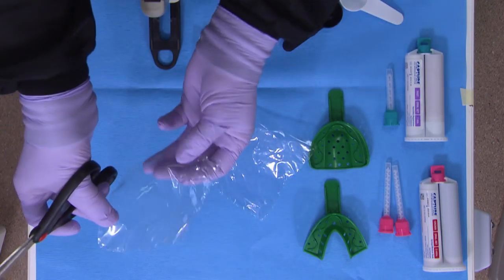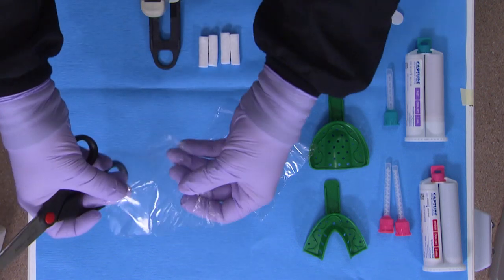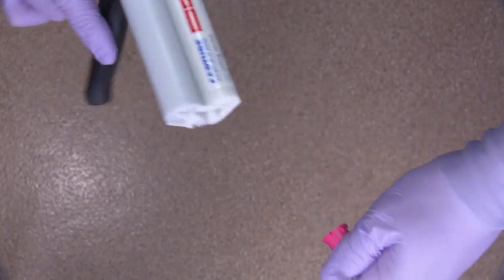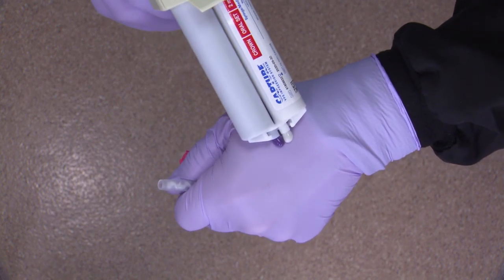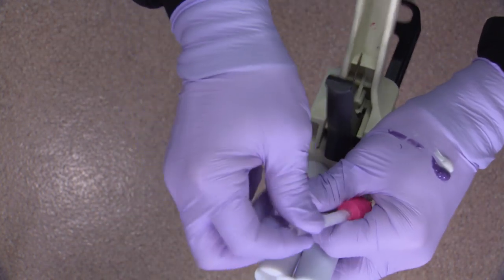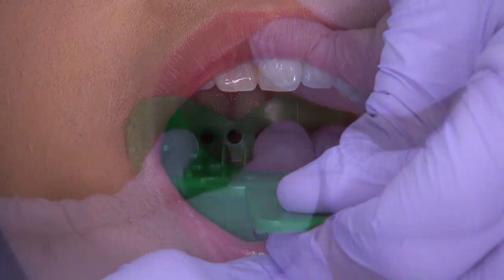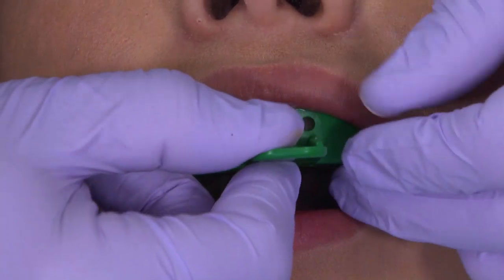Now cut each square from the midline of one side to the center of the square. This is just to give the plastic some flexibility to be manipulated during the impression process. It's also recommended to bleed the VPS syringes for the initial use, as well as every time the tip is changed, to make sure a uniform 1-to-1 ratio of material is always used. Try and incise both the upper and lower impression trays first.